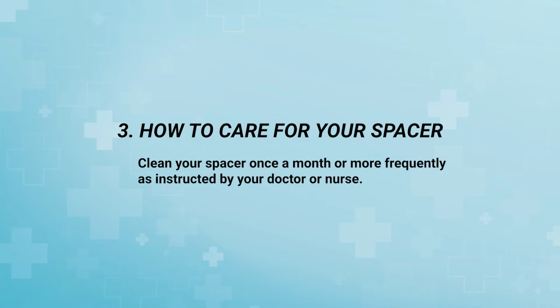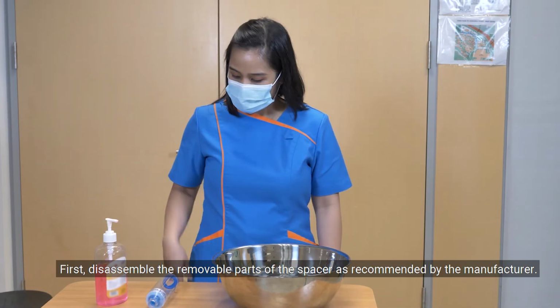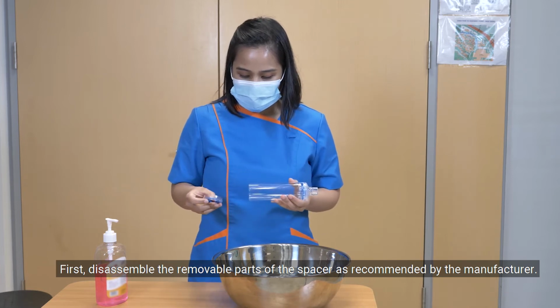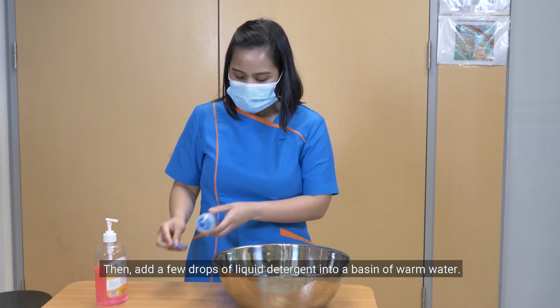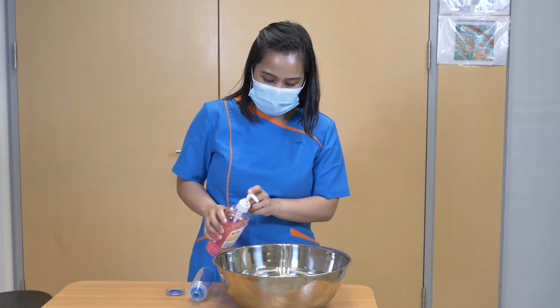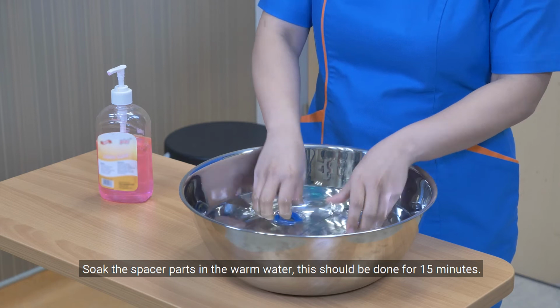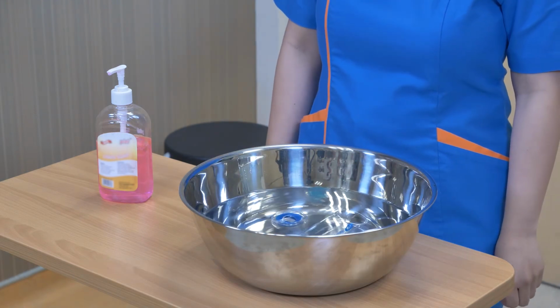Clean your spacer once a month or more frequently as instructed by a doctor or nurse. First, disassemble the removable parts of the spacer as recommended by the manufacturer. Then, add a few drops of liquid detergent into a basin of warm water. Soak the spacer parts in the warm water, and this should be done for 15 minutes.